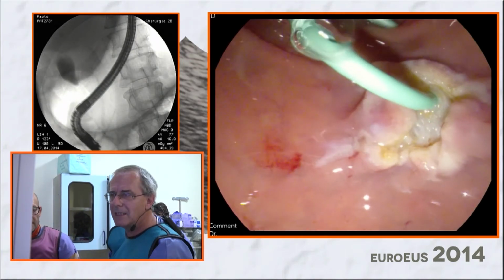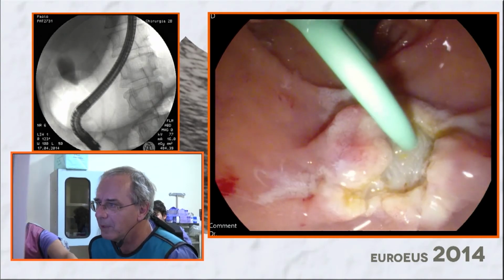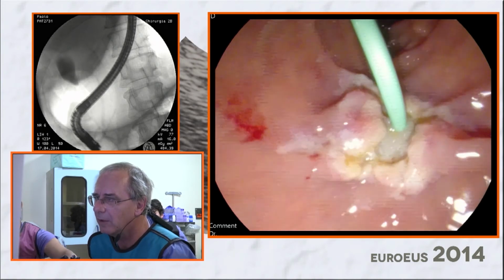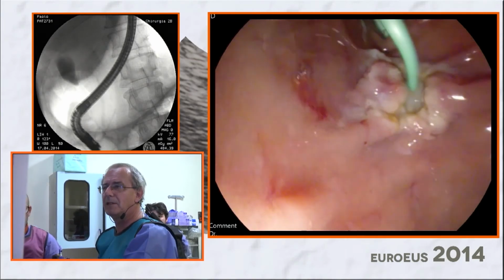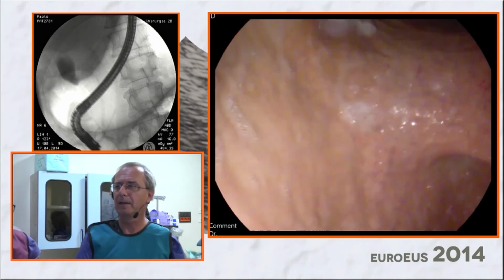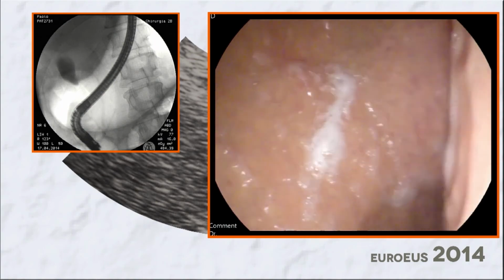Okay, so the hemostasis looks good. I hope that this part of the tumor has also been completely removed, the LST part. Apparently, yes, but we have to check in 3 months. Okay. Excellent. Okay. Thank you very much. Thank you. Thank you very much, Guido.